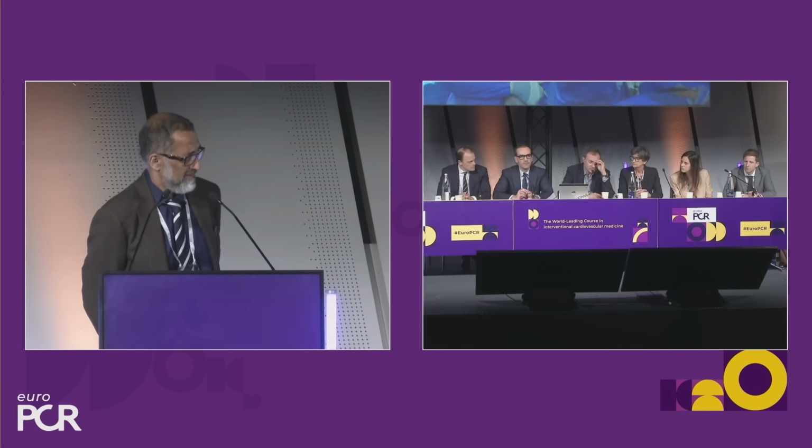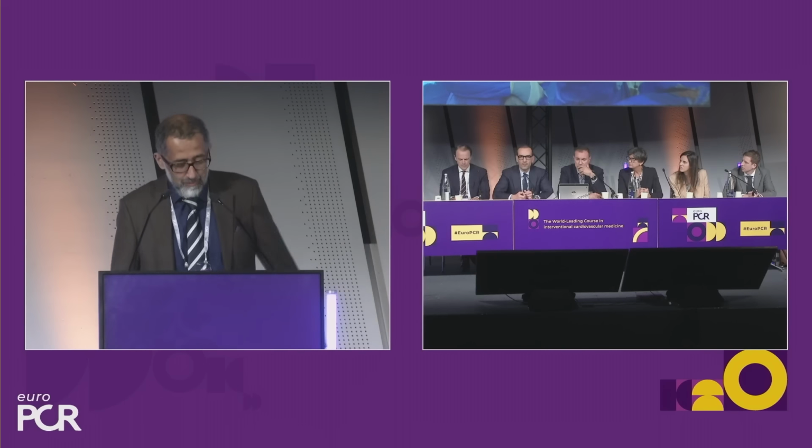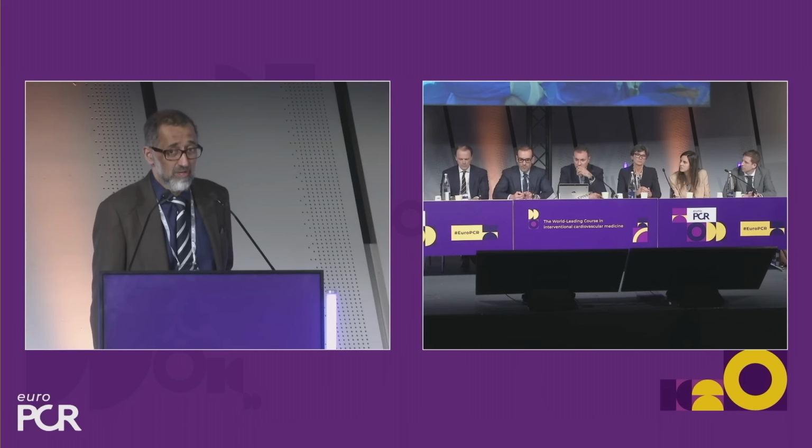Iqbal, there's a comment or a question from the audience on that note as to why you didn't post-dilate it, because the frame geometry seemed a bit underexpanded. And on that note, I missed actually, what was the gradient and the EDP? So the gradient at the end was 0. It'll come in the presentation, 0 and 0. The EDP hadn't changed. And it allows me to make the point about coronary perfusion pressure and AI index, because we actually do hemodynamics on every single case. And we do an echo in the lab on every single case.